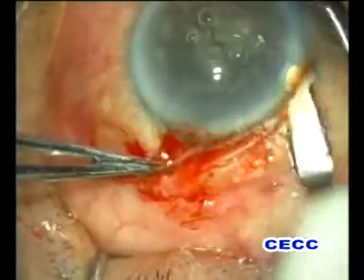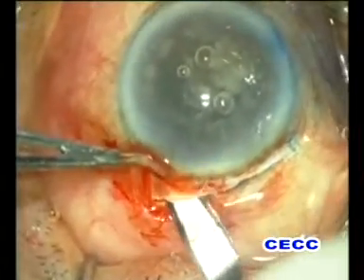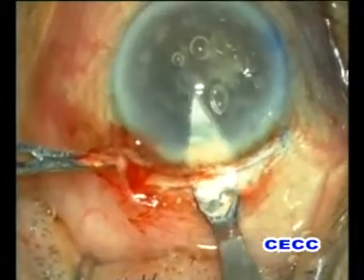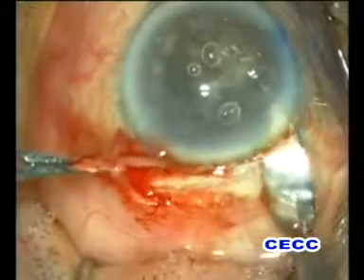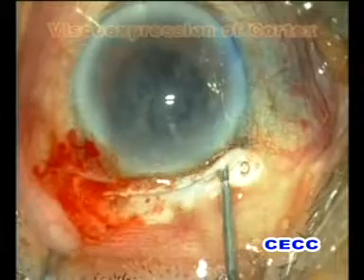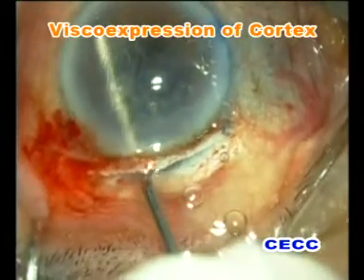The tunnel was imparted a trapezoid shape by greater lateral extension of the dissection on the corneal side. Finally, the internal wound was also enlarged with the angled keratome. This way we can expect to retain most of the benefits of a valvular self-sealing incision, which is so important in a patient who is likely to become uncooperative at any moment. The nucleus was expressed from the anterior chamber using the irrigating vectis with adequate viscoelastic protection.